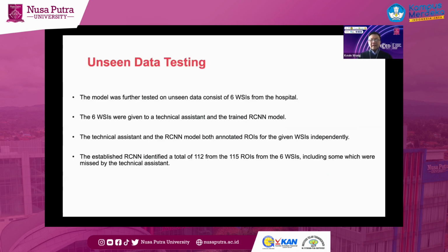So a lot of time in deep learning experiments, we have training data and we have testing or validation data, but you realize that with those kinds of data, sometimes you can optimize the model to give you the best result. And the pathologists know about this. They come back to us and say, no, we're not going to give you all the data. We give you 60 and 12, but we keep the 6.